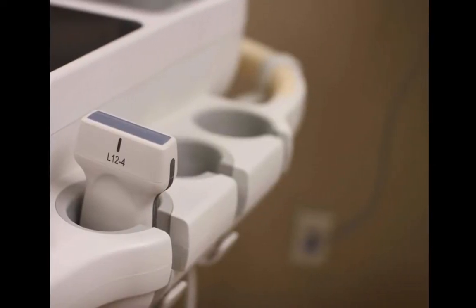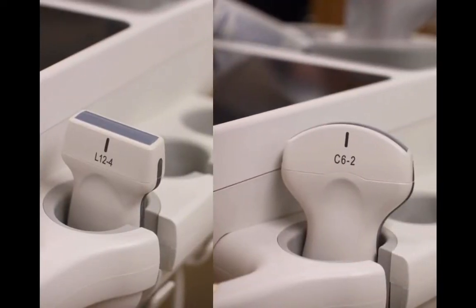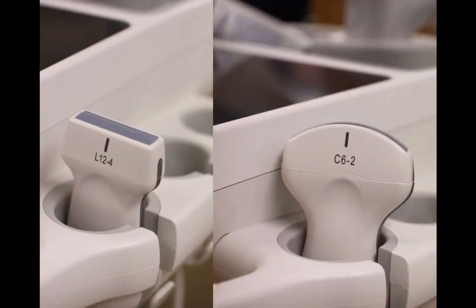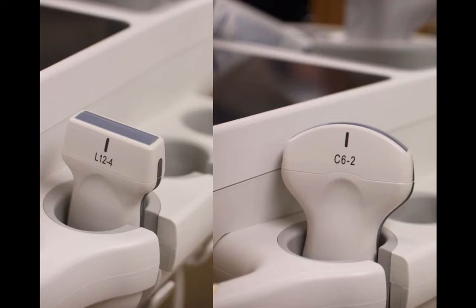Your probe of choice is still going to mostly be the linear probe, but if you have a patient that's a little more fluffy, you might want to use a curvilinear probe as well, but the linear probe is going to give you your best images.